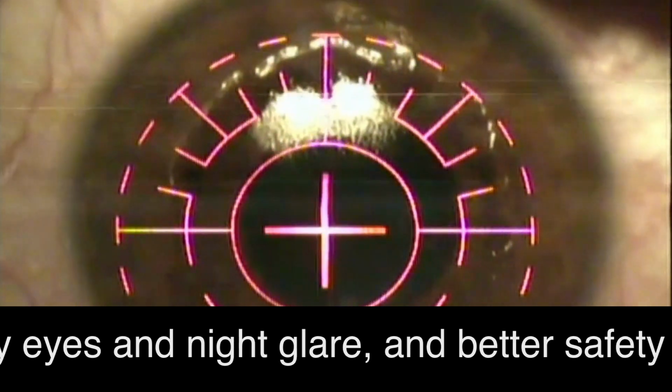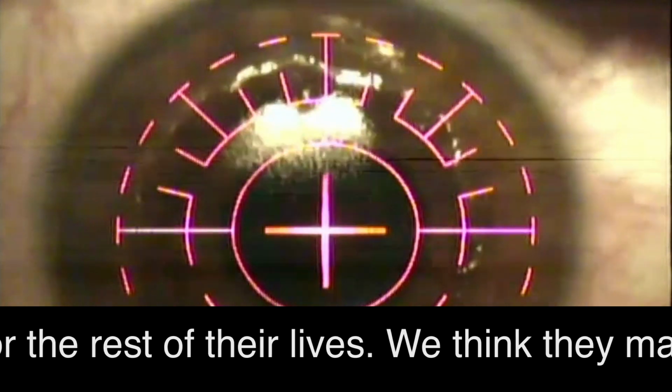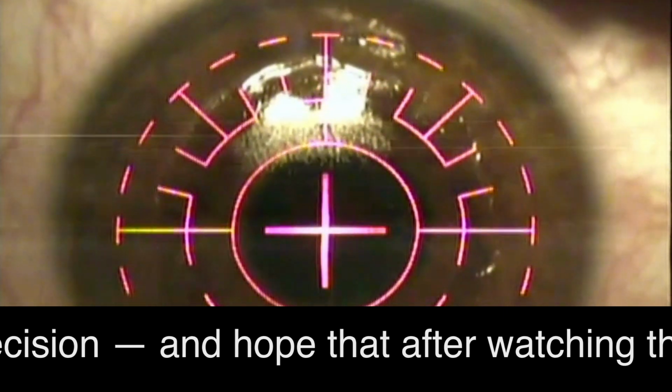This is just the laser, and you can see the blue light is the fluorescence on the cornea, and that's part of the cornea getting vaporized. And when you have this done, you're going to smell something like burning hair. It's not burning, it's not a thermal process.